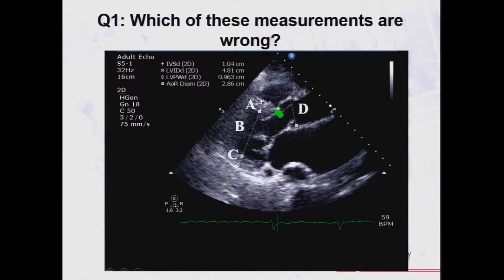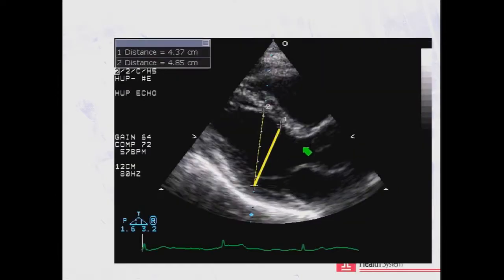Although you time systole and diastole by the movement of the mitral valve, you can't take as end diastole a clip where the aortic valve is open. And if you look at the new aortic guidelines, which were published in JASE in January, the aortic root measurement should also occur at end diastole. So all of these measurements are incorrect.